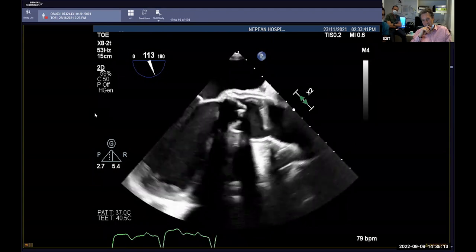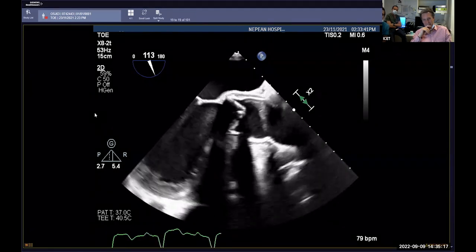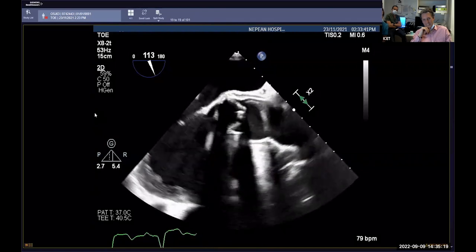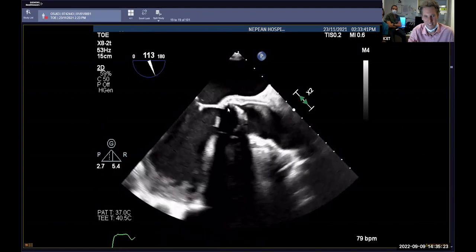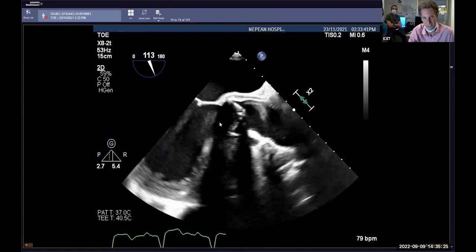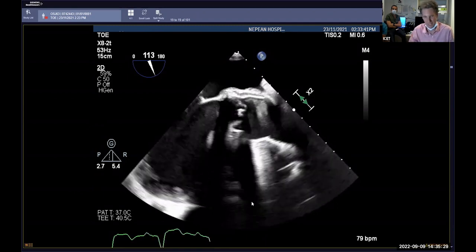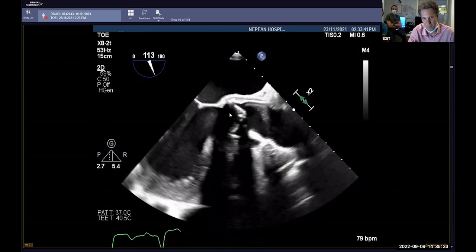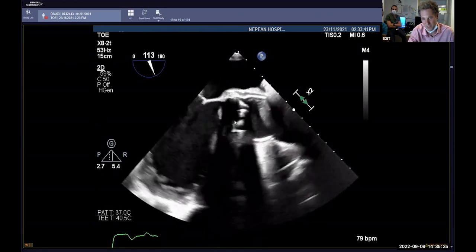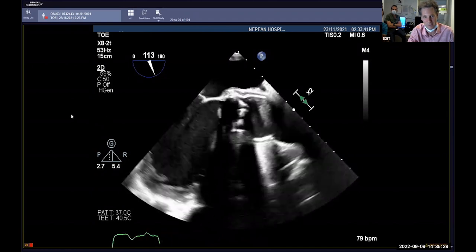I mean, this is something that I would be immediately horrifically concerned about. Yeah. Probably from my perspective, consider it to be a surgical emergency and consult people very promptly. That's absolutely right. So here we can see it's really having the echogenic structure with independent motion, even though you've got all this artifact. So it's probably a metallic valve that's sitting in there. And we're just not seeing valves opening properly because it's got some form of endocarditis in there with that massive 2D defect. So absolutely, surgical emergency.